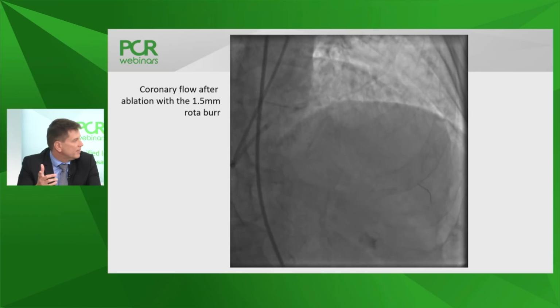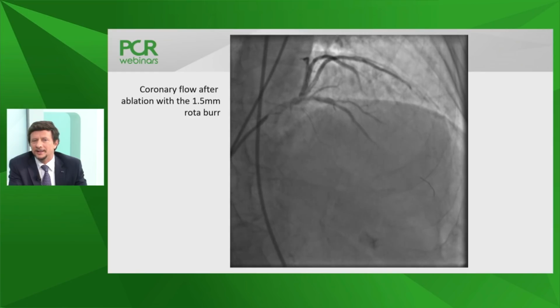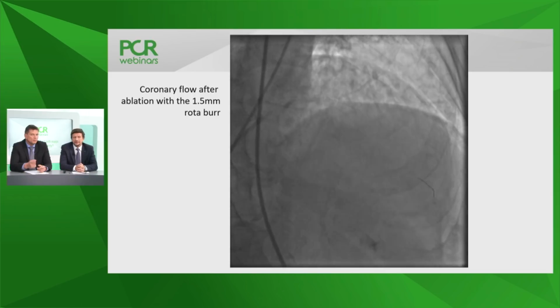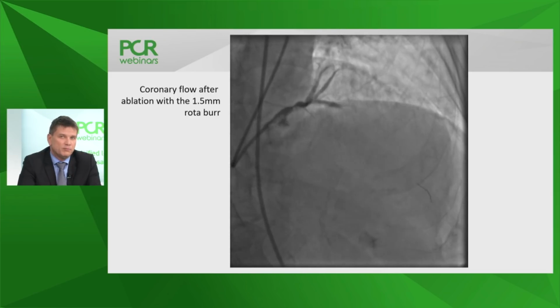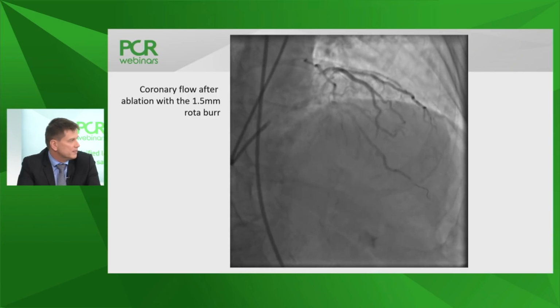The patient had no pain at this moment. Probably he has a long-lasting ischemia, so he had a kind of preconditioning. No chest pain, no ST depression. But what I think is what I would do most likely, because it's a big left main, it's big proximal vessels, I think we should upsize at least one step, 1.75.